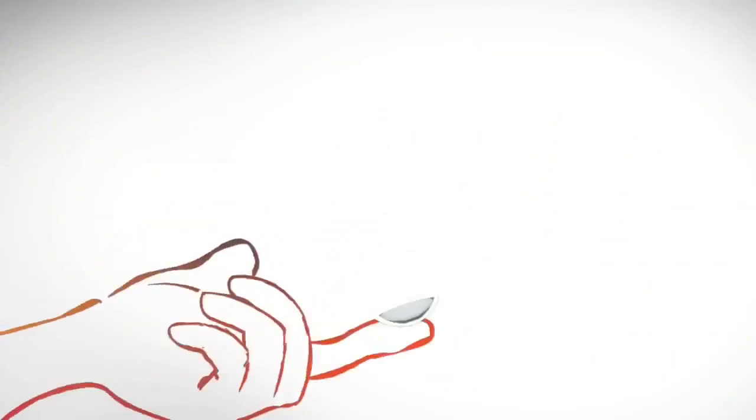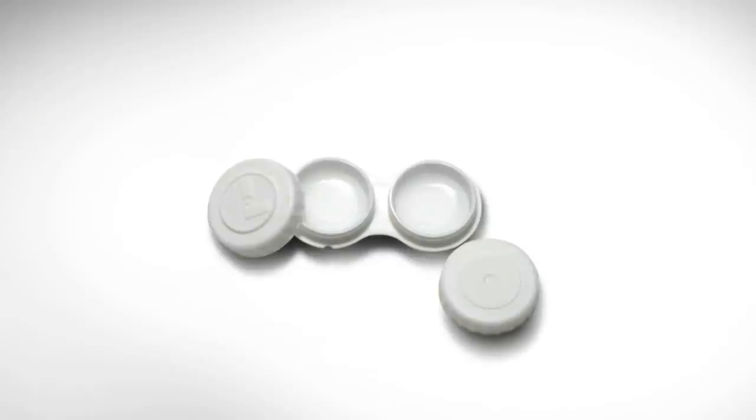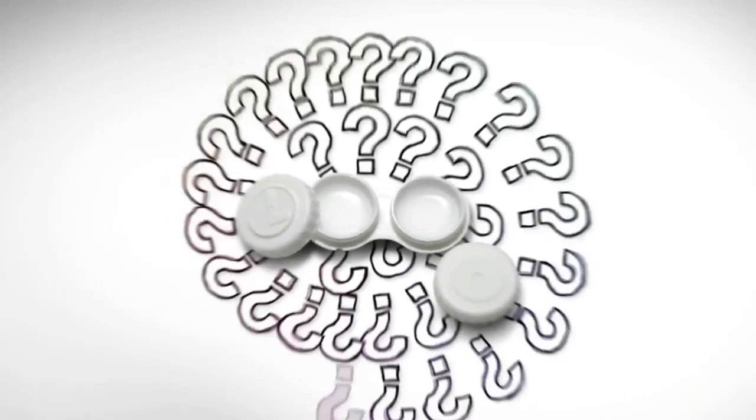Handling your contact lenses gets to be second nature pretty quick. Here's a typical contact lens case. Quick, are there lenses in it? With some brands, it can be hard to tell. Tricky.